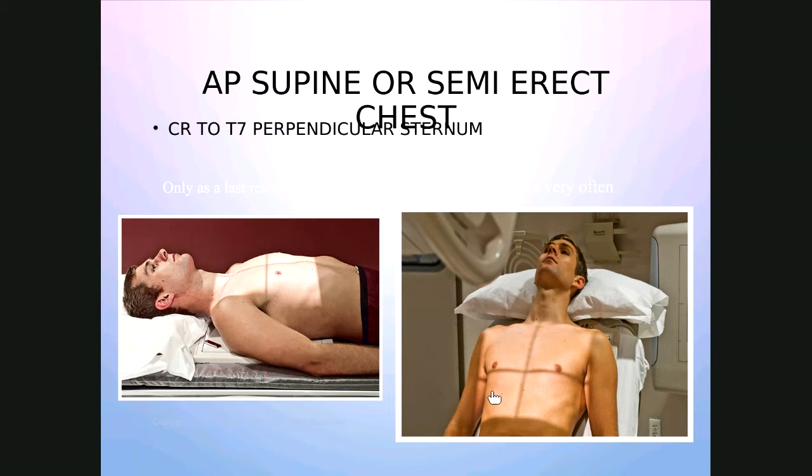And I know we've talked before that typically T7 falls about nipple line. When you're doing it from the front like this, remember you're going to use jugular notch as your guide. And we said that typically it's 3 to 4 inches down from the jugular notch.